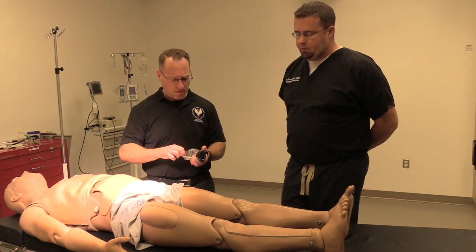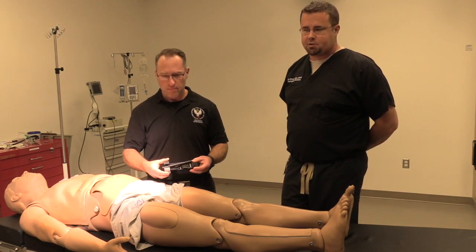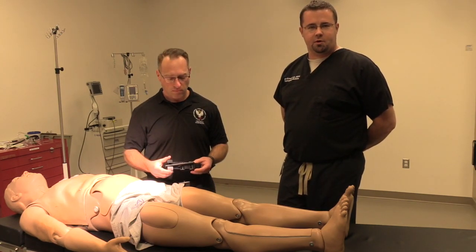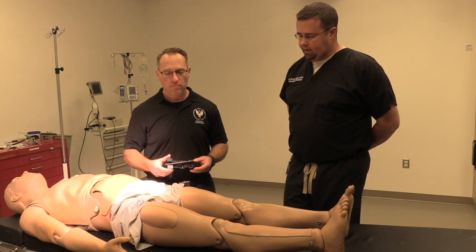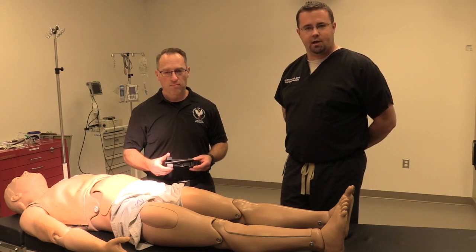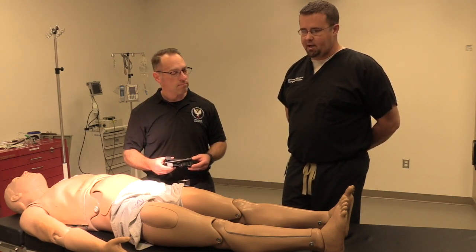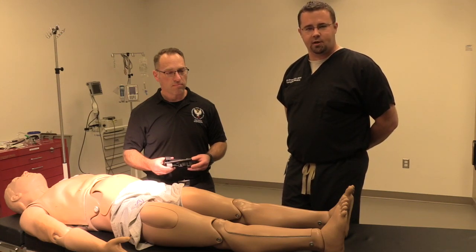So any type of life-threatening bleeding, obviously we want to try direct pressure, but when you look at some of the literature, TCCC and some of the trauma literature, PHTLS, if you have a concern for a pretty significant bleed, the idea is to try to stop the bleed as quickly as possible. So moving to a tourniquet quickly and rapidly for what you would presume is life-threatening hemorrhage, that's okay, and that's where we want the mindset, as opposed to sitting there trying to apply direct pressure for 5-10 minutes and it's still oozing. If there's any question, moving to the tourniquet is okay and it's a safe thing to do.